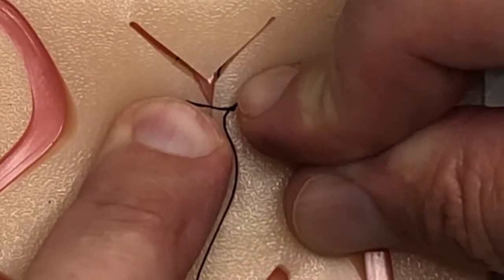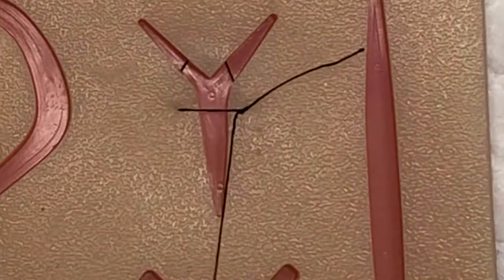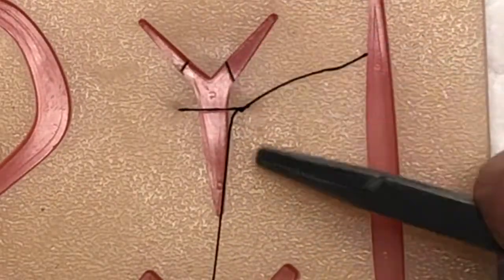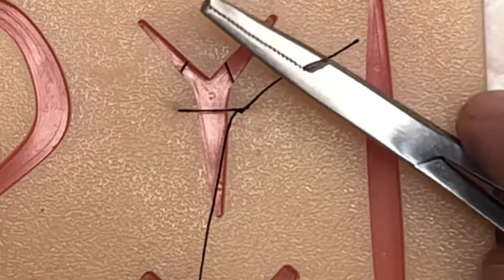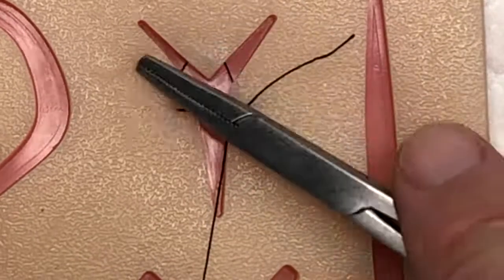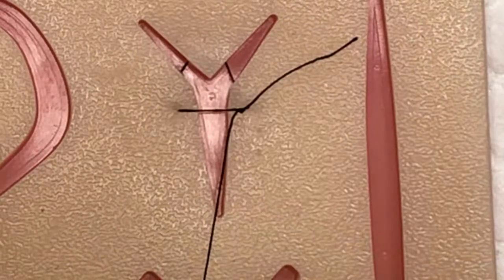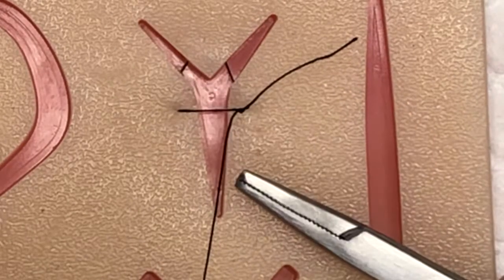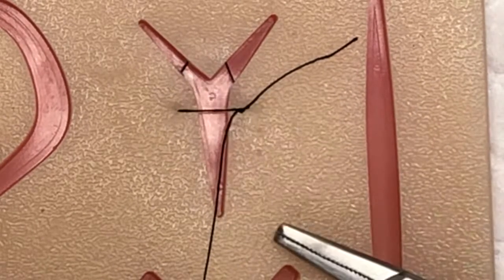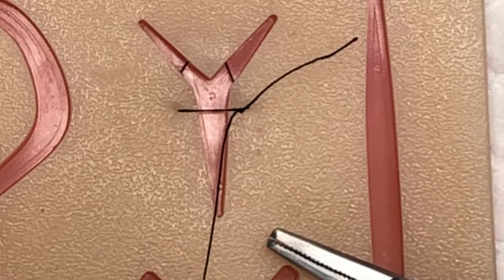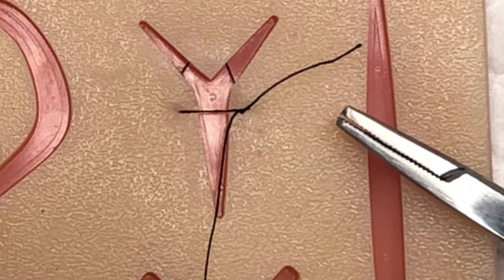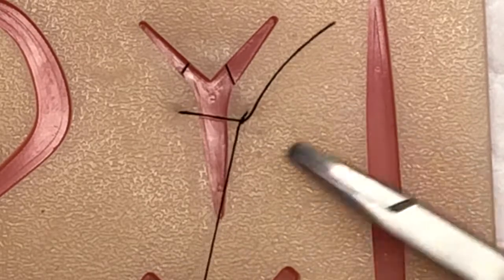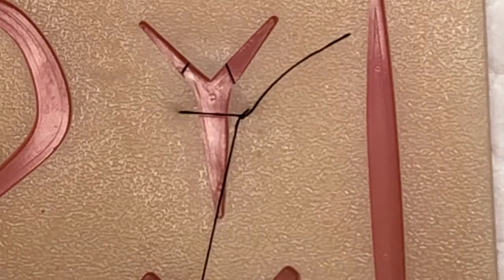You tie that off, and then you can start going into the other ends of the laceration and putting those together. If there's a lot of tension, you may want to utilize some horizontal mattress sutures. If there's not much tension, or if it's a very short length, then you can just use some interrupted sutures there. So that's how I approach these Y-shaped stellate type lacerations that may have a lot of tension is the modified horizontal mattress suture.